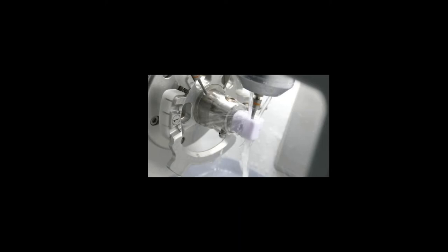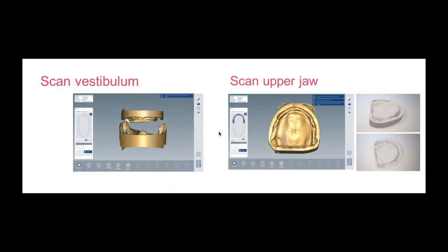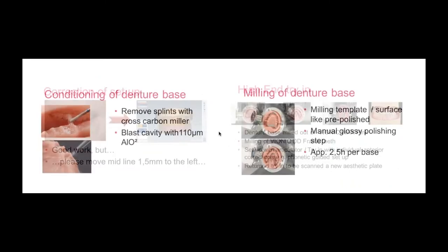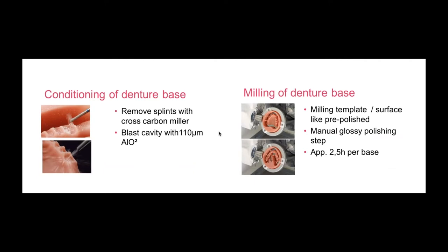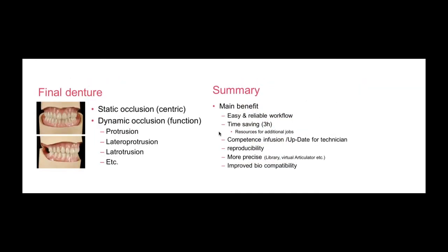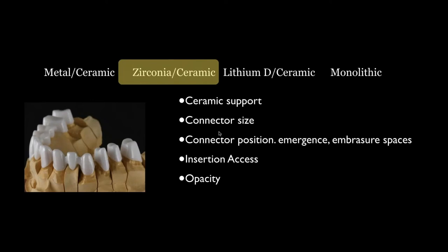And obviously having the systematic approach in my software to be able to approach all of those is kind of the key for me. And let's be clear, I think I'm leaving tomorrow or the day after for Arizona for a digital denture symposium. Even in this world today, the digital process is taking effect. So how many things can we do where we can actually scan, transfer the information, not have to use impression material in the patient's mouth, and then be able to use all the same processes to mill a denture base, or maybe go back to some denture teeth and cement them in place, and then actually create almost a fully processed digital denture, which is pretty amazing. So all these things are fabulous. But in the end, our job is to know when, where, and why.